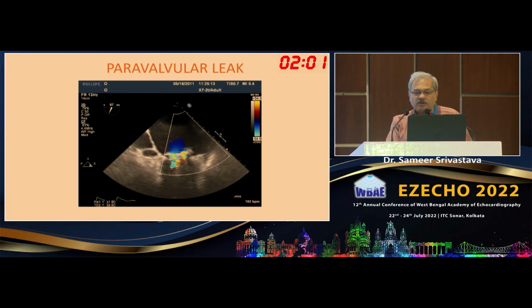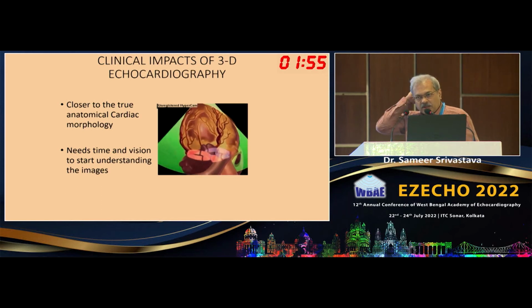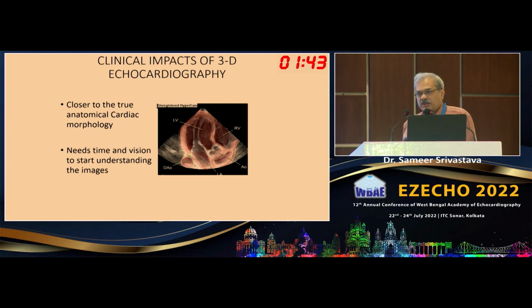So things have come a huge, big way, and from the clinical impacts of 3D echocardiography, we are here in an era where there is some substantial change as is needed, and echocardiographers are making themselves more worthy in patient management. With all modesty, thank you very much for patient listening.